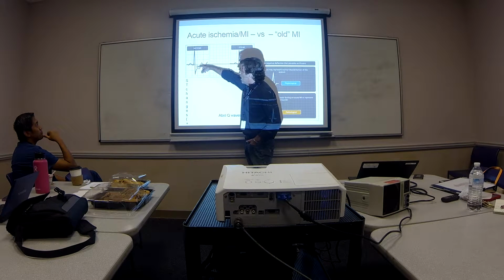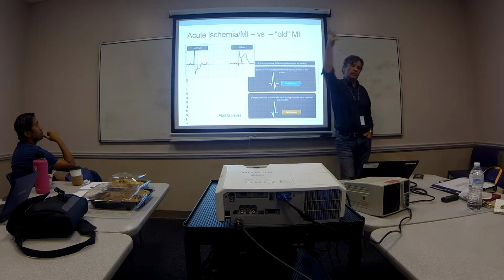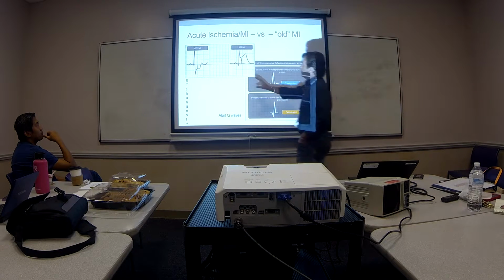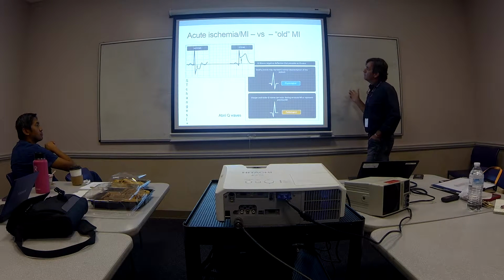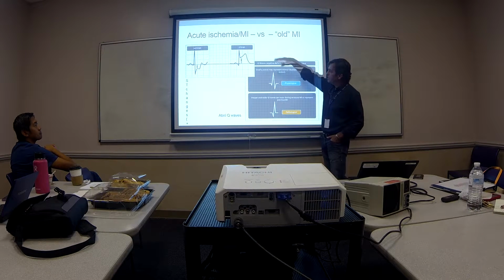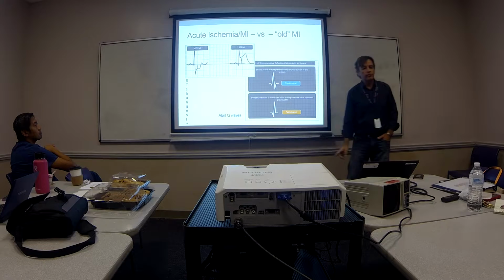They can either drop massively, see there's a baseline if you will, or they can, more commonly, elevate. We commonly call it ST elevation infarct or non-ST elevation infarct. So these kind of massive changes plus the right symptoms, that's an acute infarct. However, as the infarct heals, the ST segment comes back to normal, but the patient who had a tiny Q wave at the beginning tends to have an even wider Q wave. Okay?